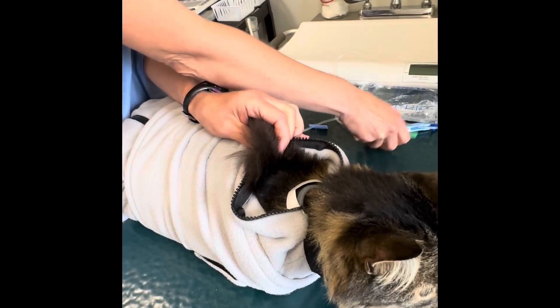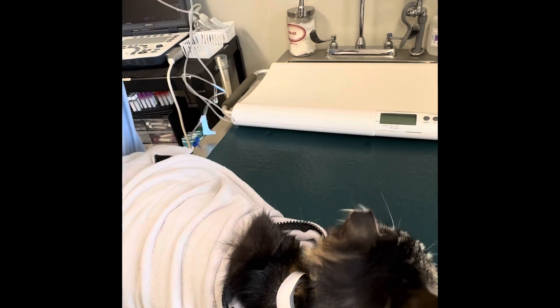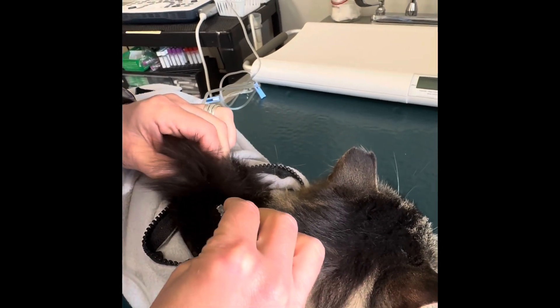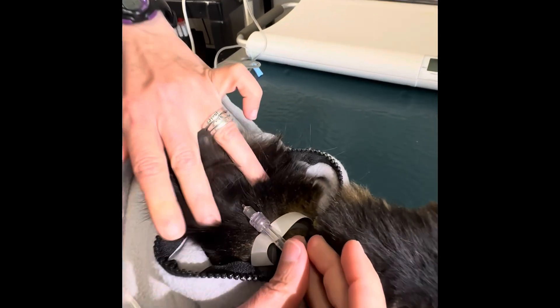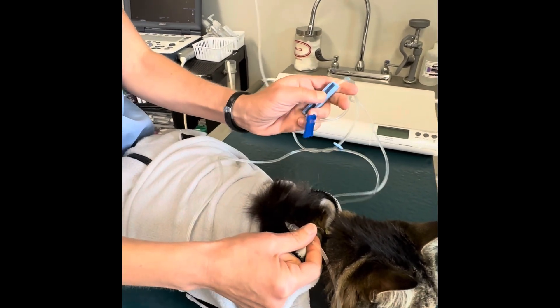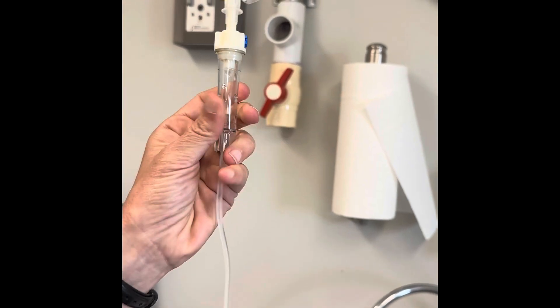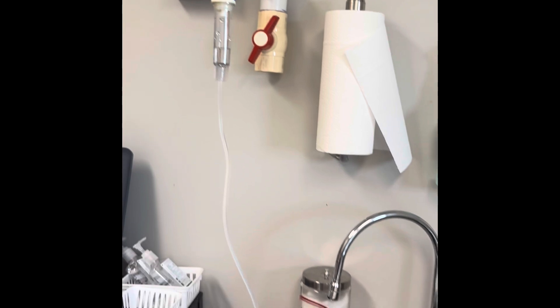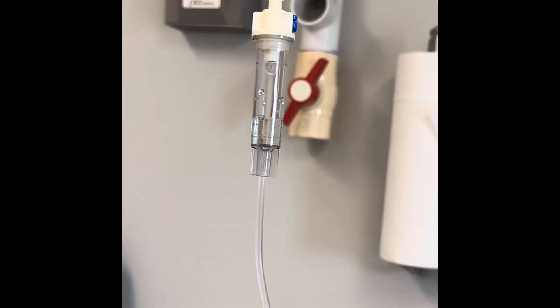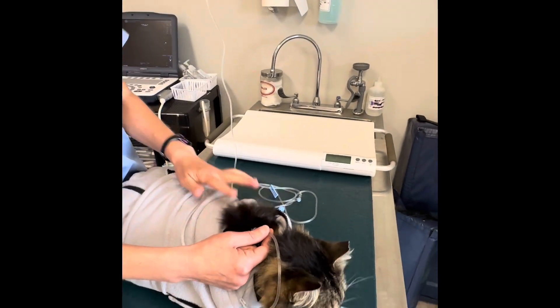I'm going to use it as if my finger is the needle — and then poke the needle in. So I'm picking up and poking the needle directly through. Now that's in — in his fur, in his skin. Now I'm going to go open up my wheel. You can see this chamber start to drip. It's not dripping really well, so sometimes you have to tinker with the pressure or see if anything is kinked. What I did is move the needle a little bit because it was probably up against the skin, and now you can see it's flowing well and dripping nicely.